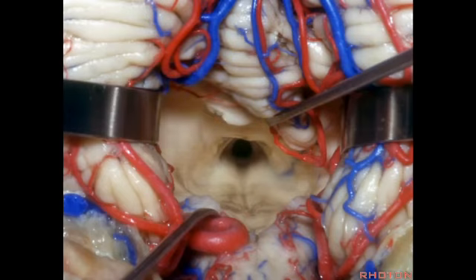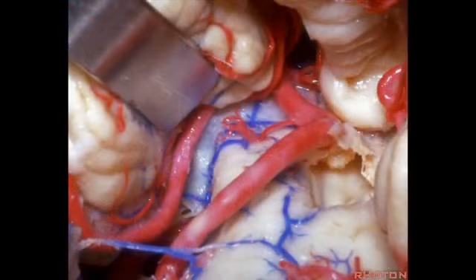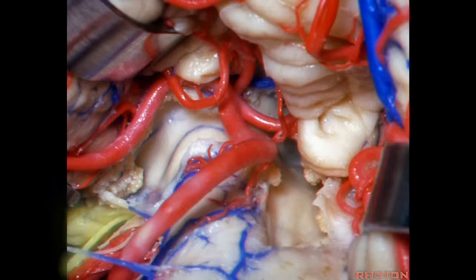And then if the pathology extends out, the lateral recess is roofed by velum and tela, and all you have to do to open the lateral recess is elevate the tonsil, open the tela from Magendie to Luschka, and you have access to all of the lateral recess. Here's Luschka behind 9, adjacent to flocculus.